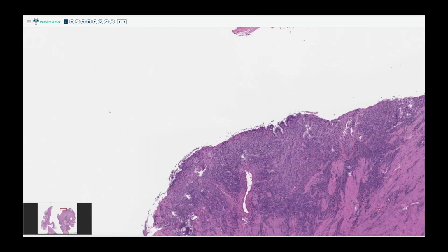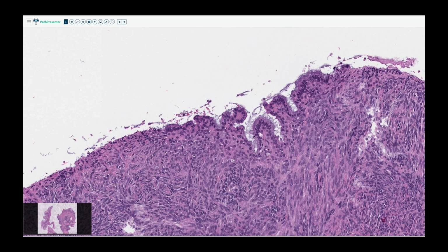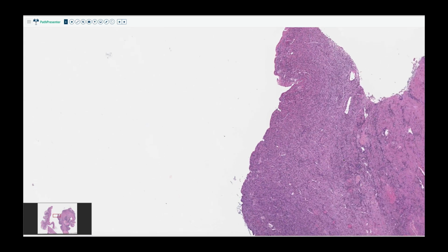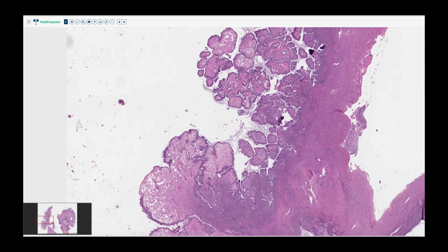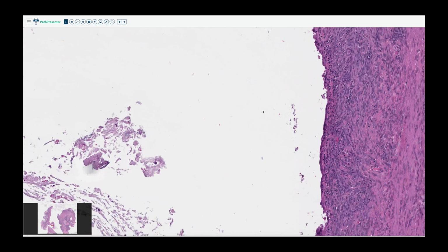And then you can see here more of a traditional cyst component, which is often the case in these ovarian tumors. One thing leads into another. But what's interesting is you are getting a hint that you see some cilia, then you definitely see some mucinous lining as well. So that's where the seromucinous tumor gets its name. These are not terribly common when you do see them. Like I said in the PowerPoint presentation, they are commonly associated with endometriosis, which is another thing I was sort of hunting for. Endometriosis is sometimes seen in areas like this, but I don't see any good endometrial stroma, so I think that's just a cyst component.